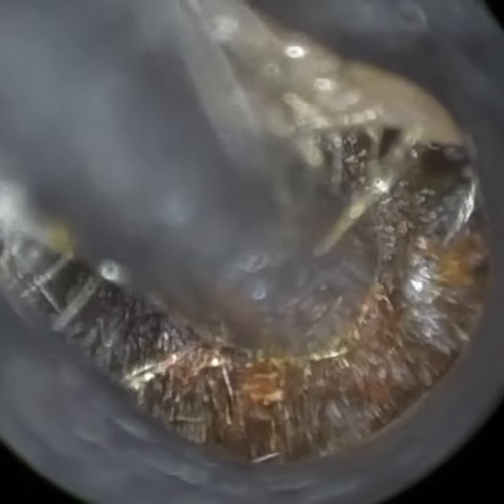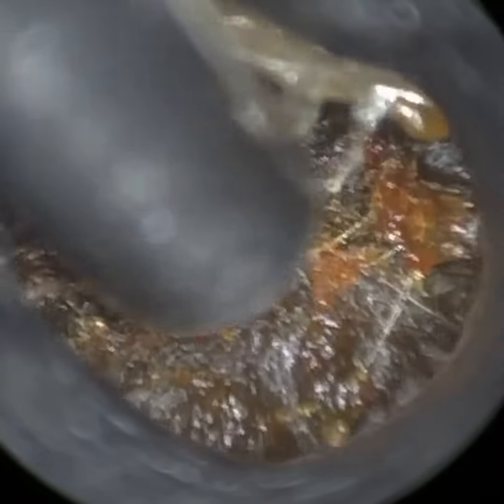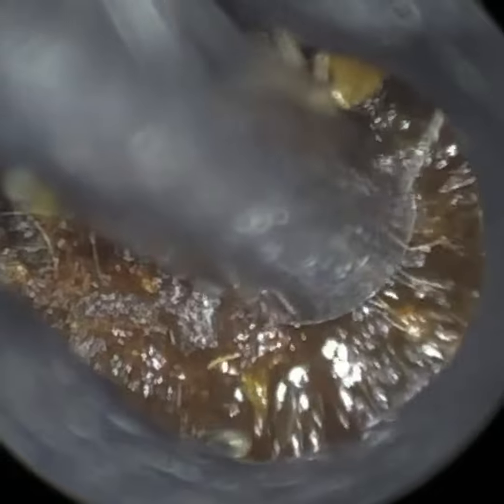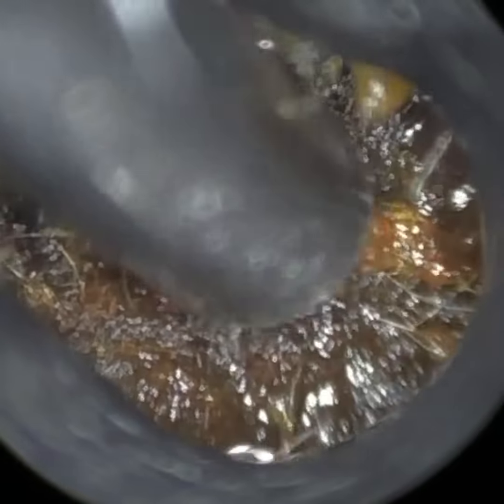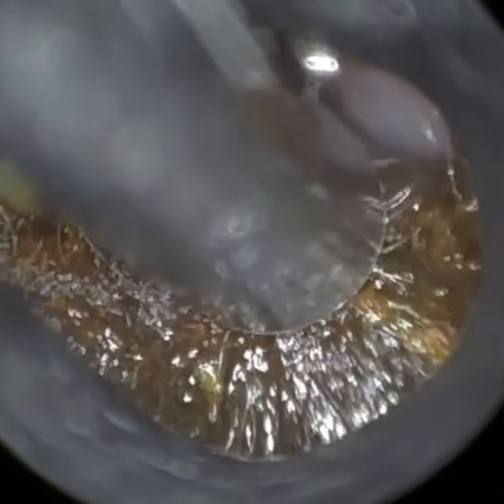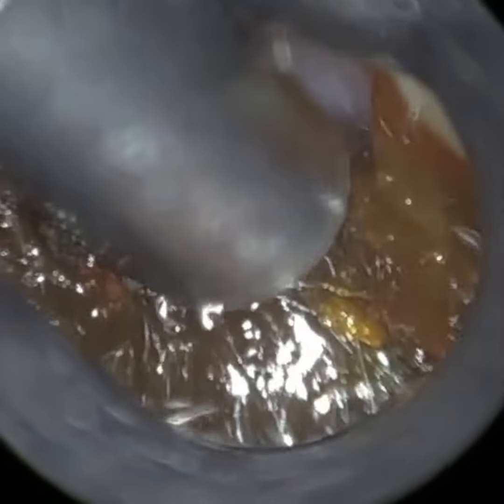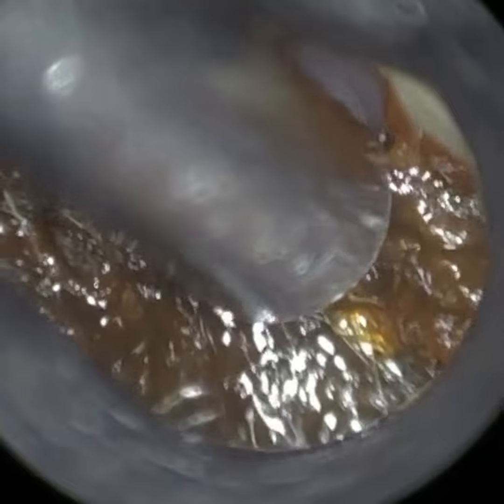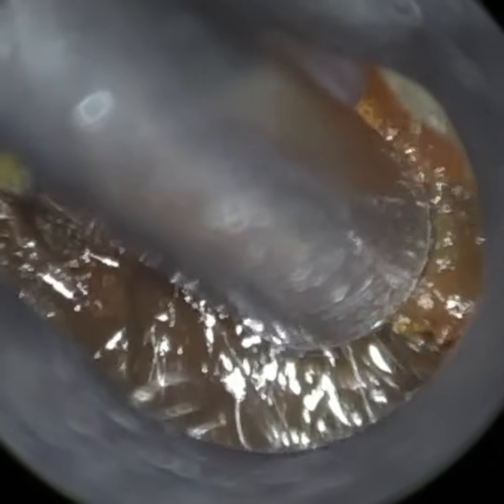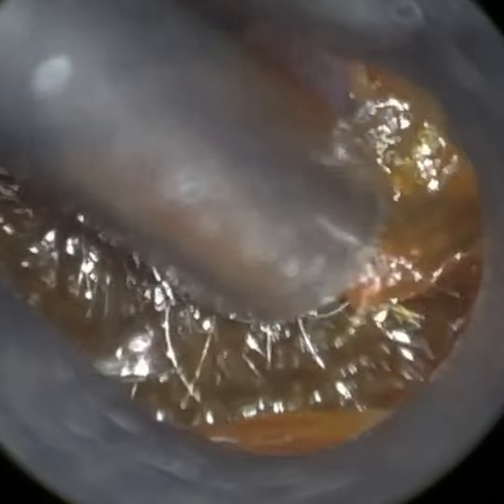I'm just trying to loosen this wax off the canal wall and it was quite a severe impaction. If you continue to watch and see the view of the eardrum on both sides, it's quite a breathtaking view. You can see just how powerful the Waxscope is in terms of providing magnification and clarity and focus. It's probably one of the best views I've had so far using the Waxscope.